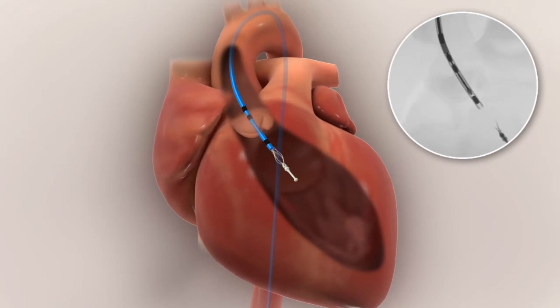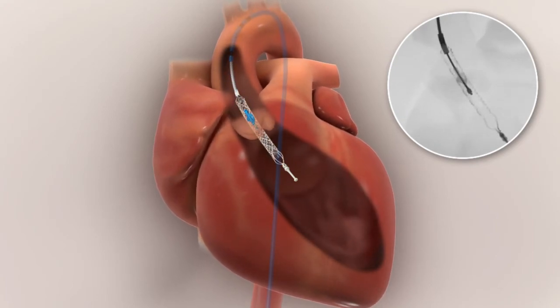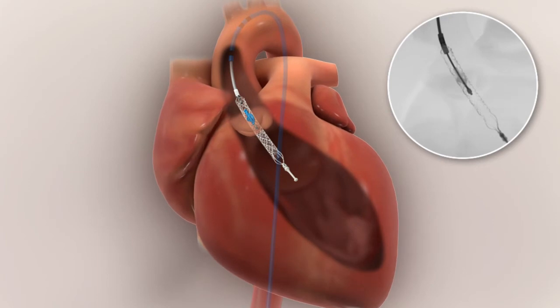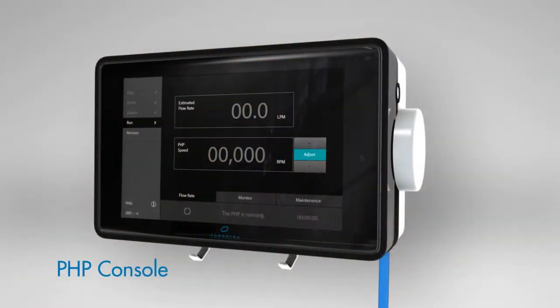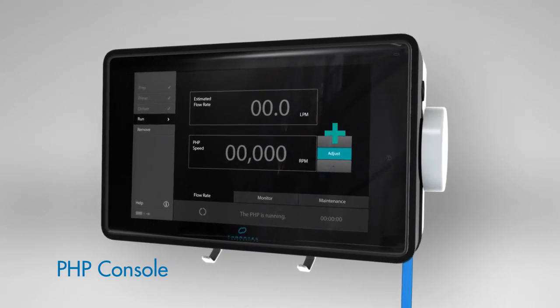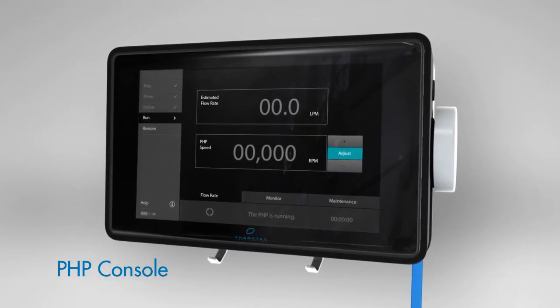Once properly positioned, the outer sheath of the PHP is retracted, allowing the covered self-expanding nitinol cannula and impeller to fully expand. The device is activated by selecting a desired impeller speed on the console touch screen.